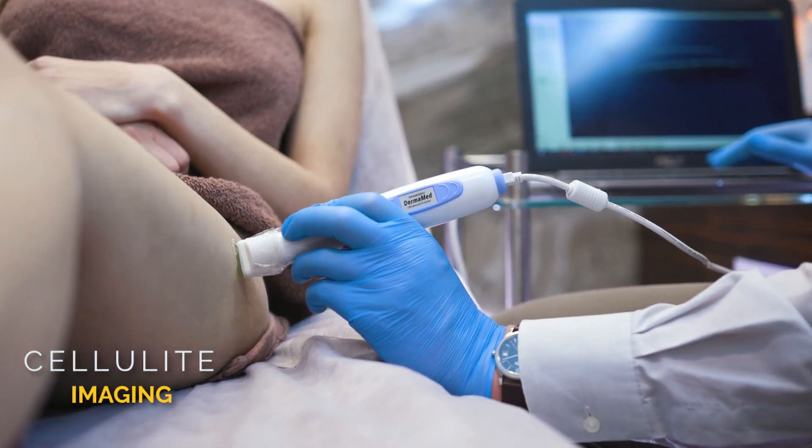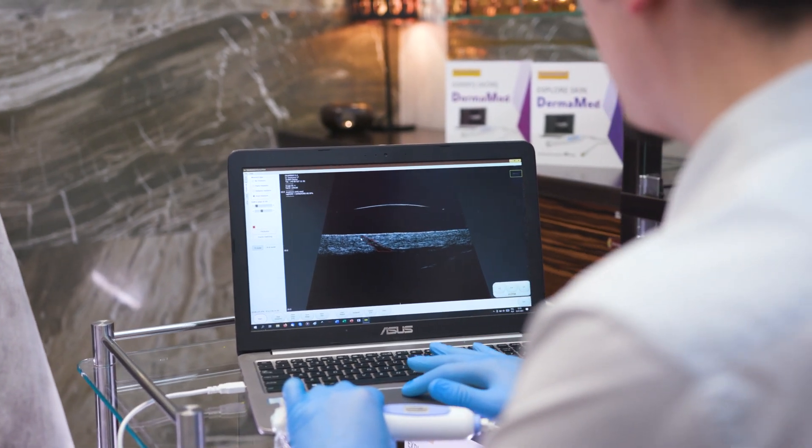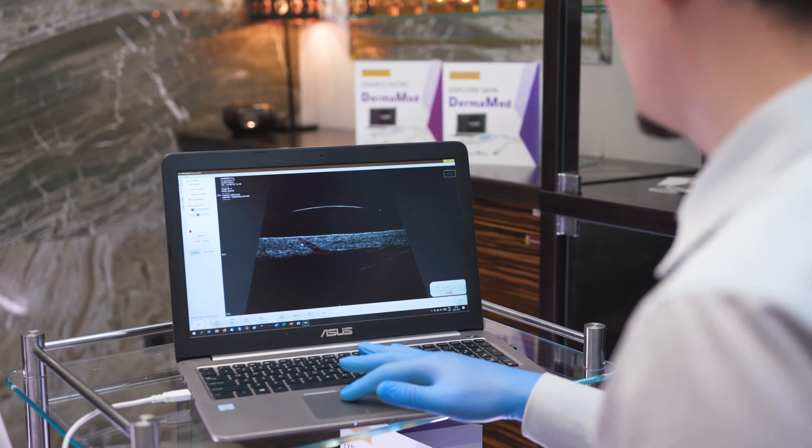Now we can see the cellulite in cross section. We can quickly measure its area, and then use the data to assess the effects of the therapy.